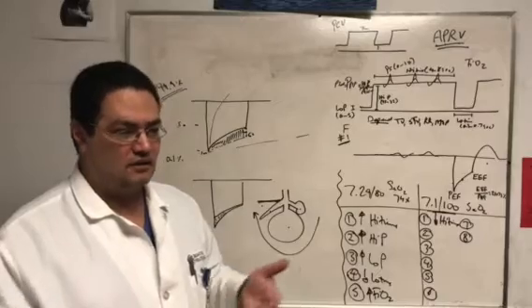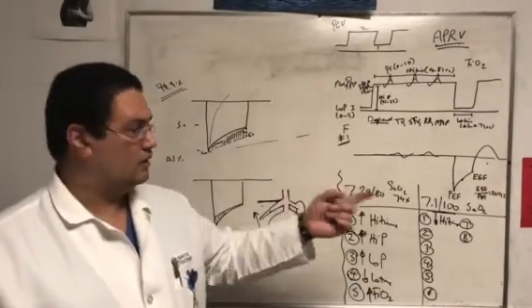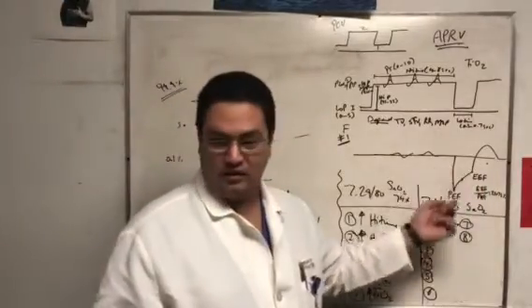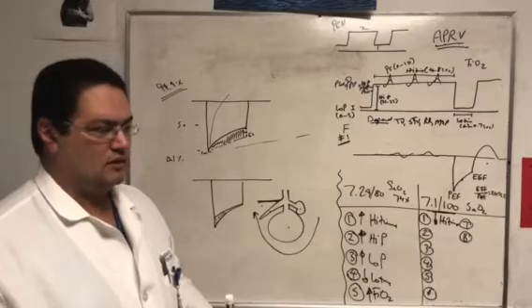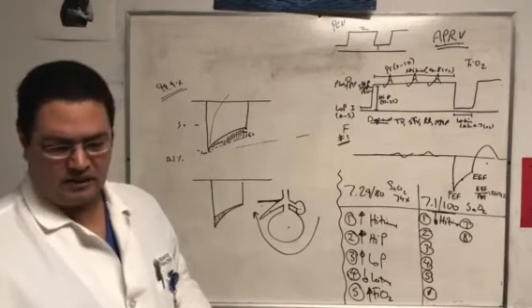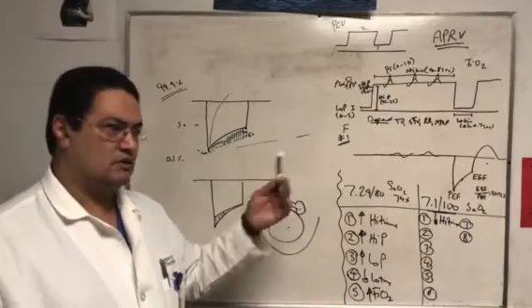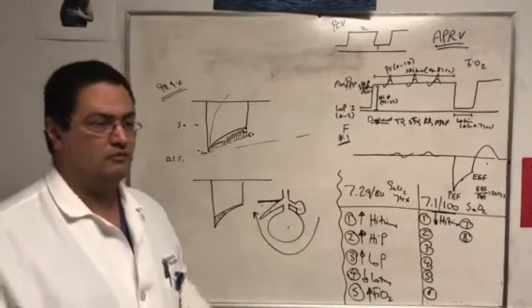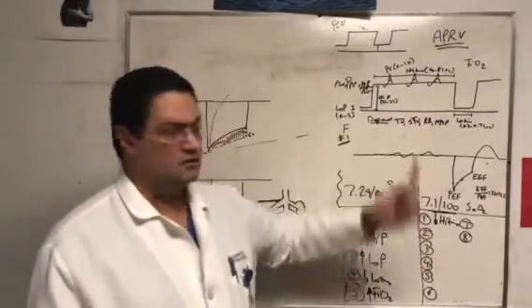It's not going to affect the big picture, and at the same time, it will play with this dangerous ratio here that can kill the patient. So we don't want to do that. Right? So that's the decreasing the high time. If the high time is 6, you're going to get about 9 breaths per minute. If the high time is, let's say, 4, you're going to get probably 13 or 14 breaths per minute. Right? So that's the high time in classic APRV.